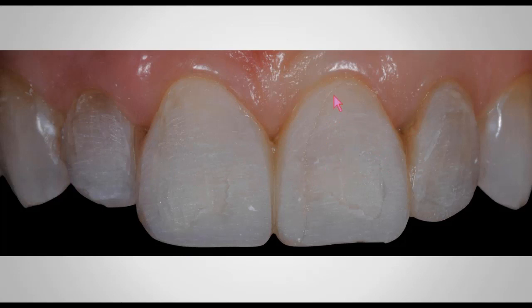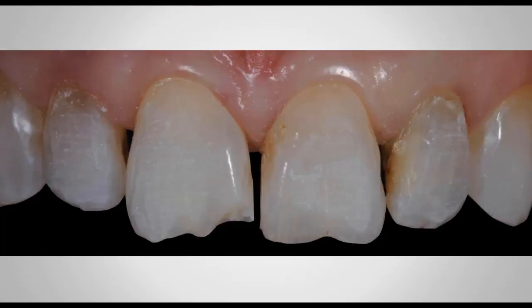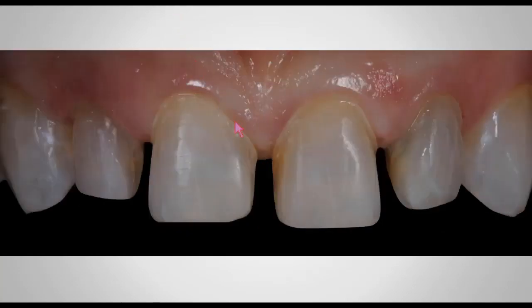You can look here, you can see here, there's a little bit of flowable composite here, but this is tooth structure. And now I'm going to remove the prototype completely, and look how very little tooth structure was removed in all 4 teeth. So all I've got to do now is give a finish line, make sure I get it in approximately so that I can close all these embrasures and diastemas and give this patient very nice looking teeth. And that's what I just did. Very shallow margin, very, very thin margin.